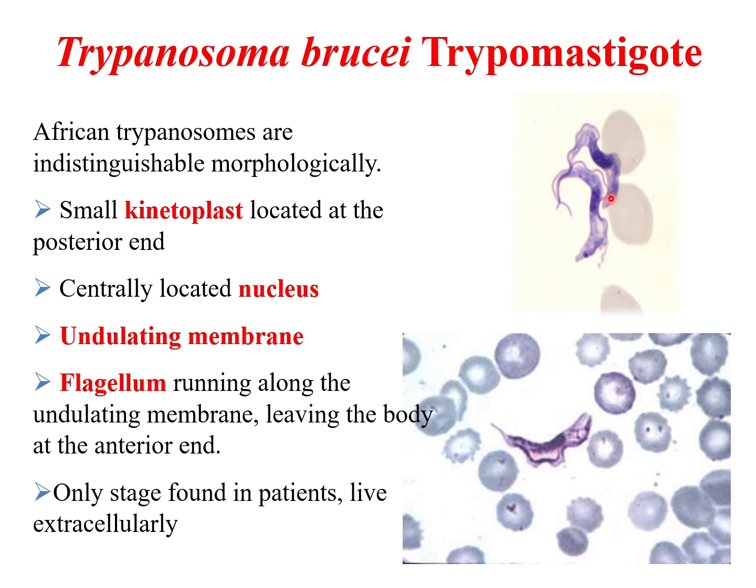And it is this flagellum, the flagellum is running along the undulating membrane that is all over the surface of the parasite. And this is the diagnostic stage we find in patients. It can be seen in either blood smears or also in the.